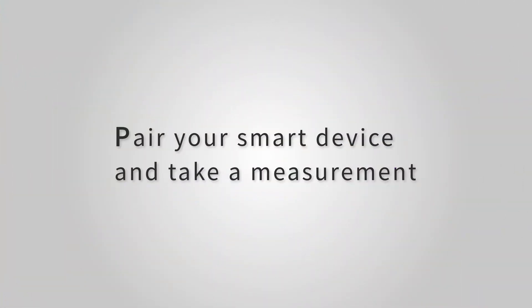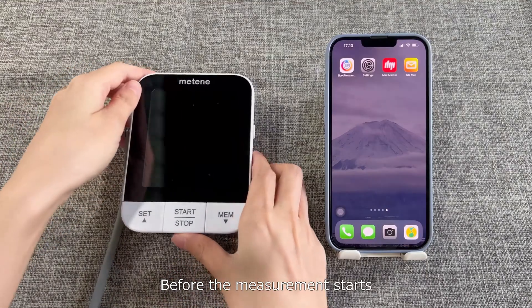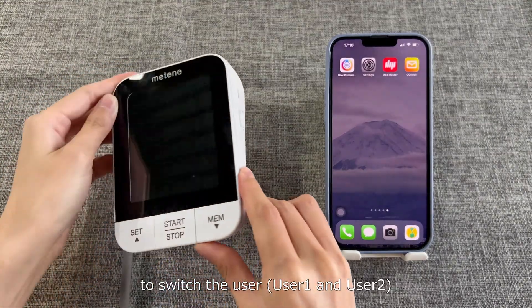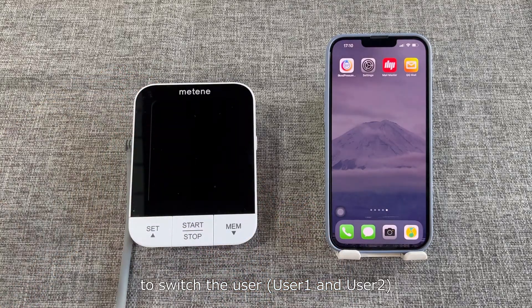Pair your smart device and take a measurement. Before the measurement starts, you can switch the user button on the side to switch the user — user 1 and user 2.